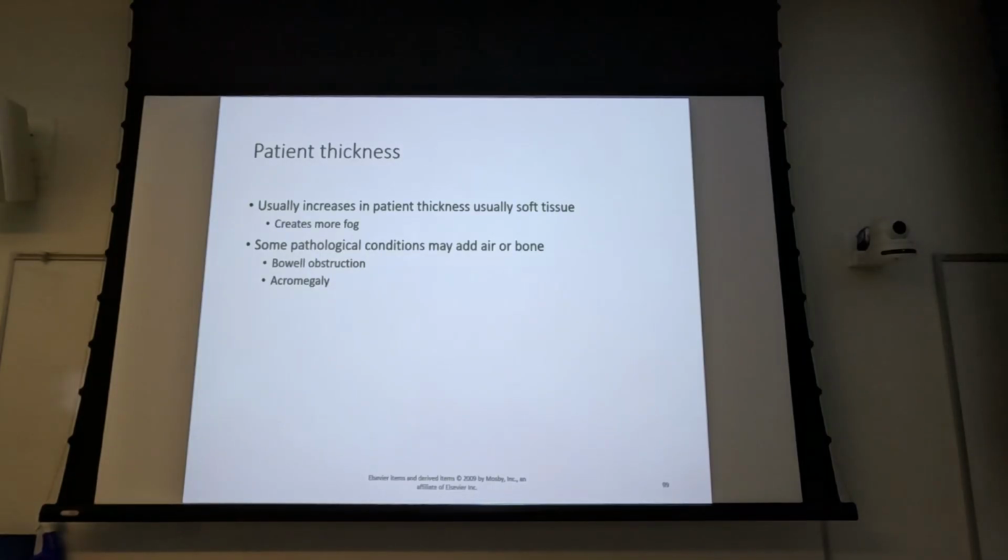So how do you know that that's due to a bowel obstruction, or is it their anatomy? Anything else? Or maybe they've got ascites. How can you tell if they've got ascites? That's just fluid over all their body. Anything? How about look at their ankles? Can you see their medial and lateral malleolus? Any representation of it? Or do they have cankles?